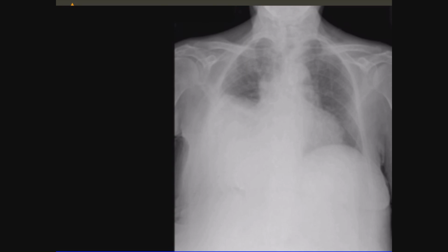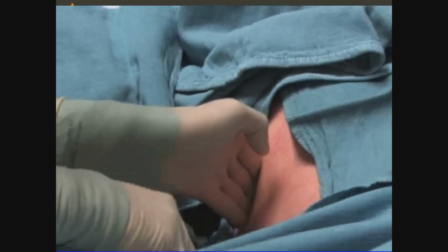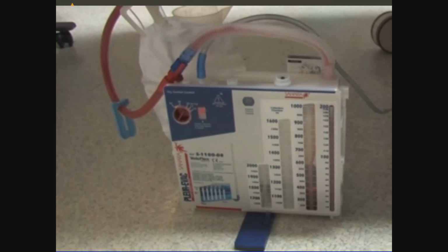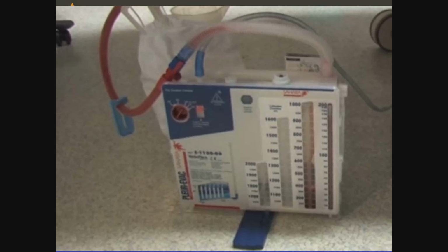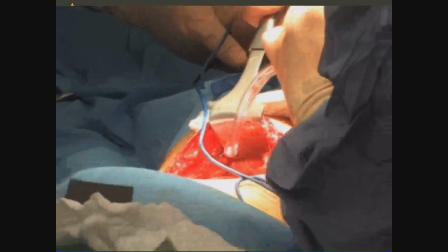If the chest tube was placed to drain pleural fluid, once the drainage volume is less than 200 cc's in a 24-hour period, and the fluid is serous, the tube may be removed. If a chest tube was placed for empyema, removal of the tube should be considered only after the patient has stabilized clinically and the drainage criteria are met. If an air leak is persistent, or the pleural fluid drainage criteria are not met, a pulmonary specialist or thoracic surgeon should be consulted for a definitive, potentially surgical management.